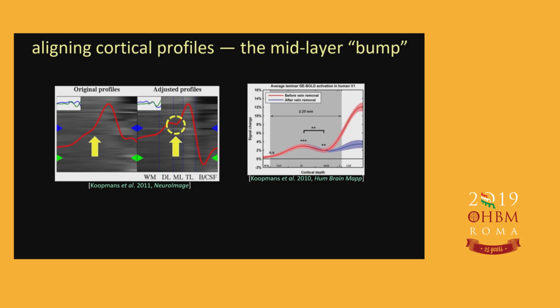And in this case, he saw this nice little decrease in the baseline fMRI signal around the location of the striae of Gennari. And this allowed them to see this increased activation within layer 4 in response to visual stimuli. So I really like this approach. It adapts the layer positioning to a detectable laminar feature. It doesn't require an estimation or prediction of the layer positions.